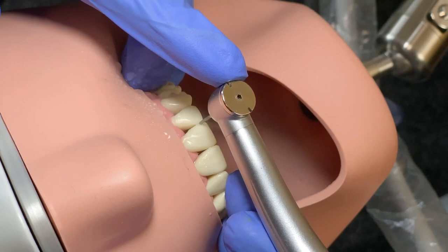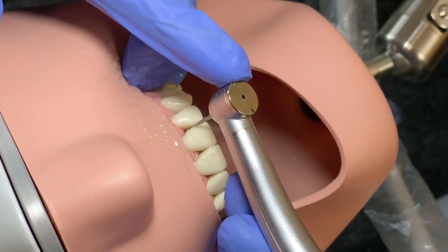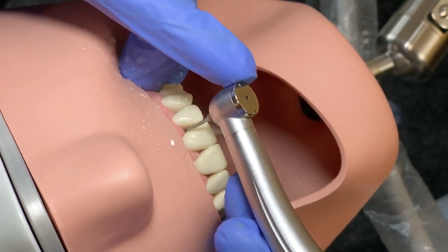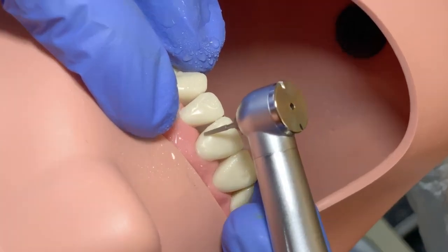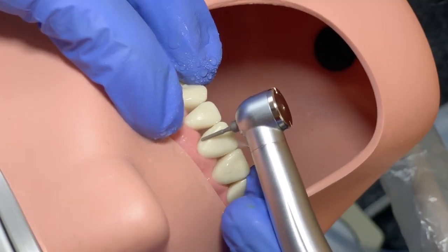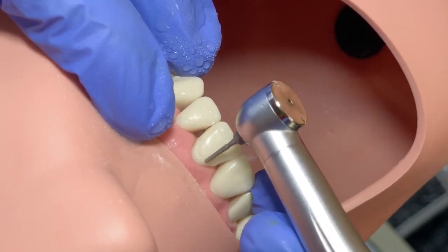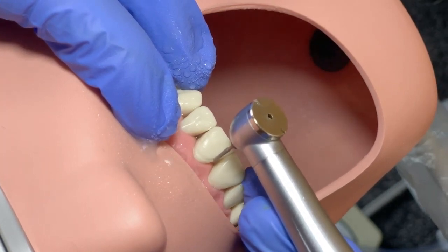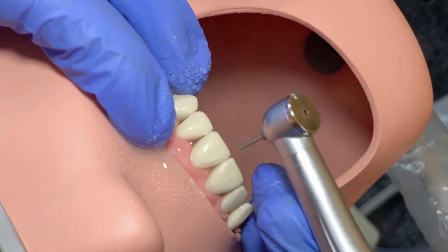Perpendicular — perpendicular. Now look at my bur and how I change the direction of the bur. It is very important to change your bur in different directions like this. Then back again — change your bur a little bit up and go back perpendicular to the tooth surface.